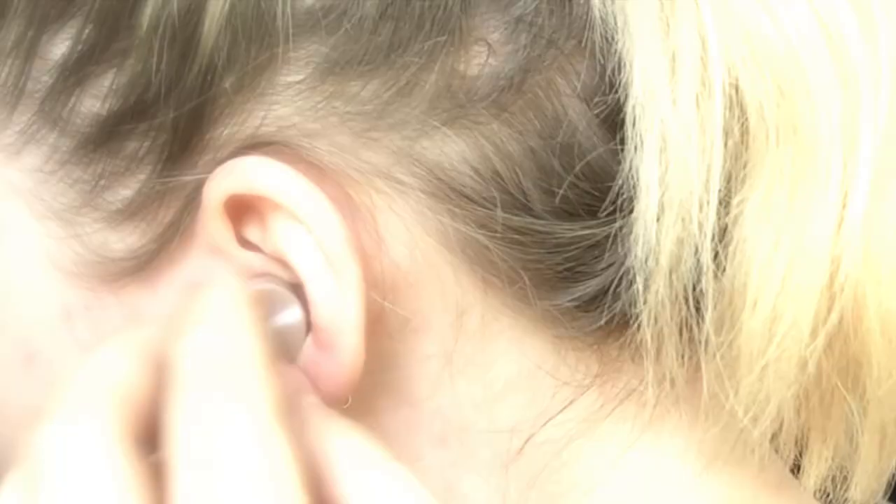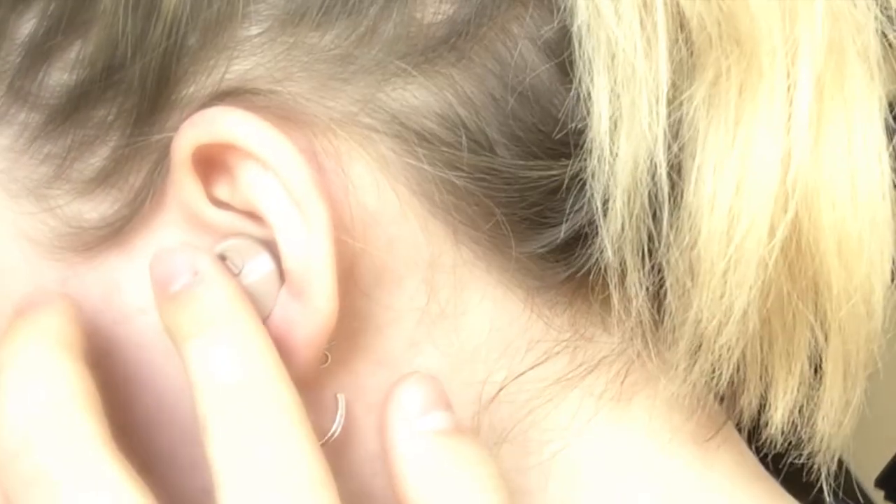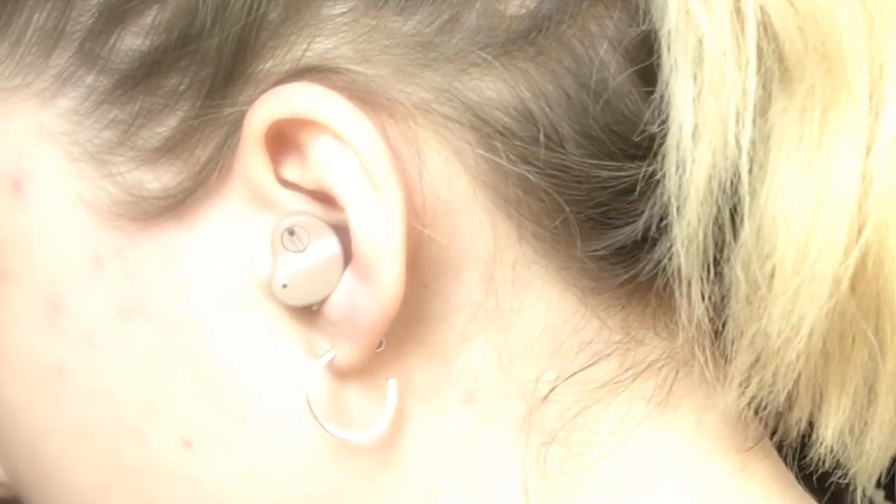I then tested it by listening to some music, and I also wanted to test the depth of the device — how far sound carries. There was a dog barking across the street. Honestly, this device is extremely muffled and didn't really work. I was singing and talking out loud to hear my voice, and it's very muffled — it almost sounds like I'm holding my hand over my ear.